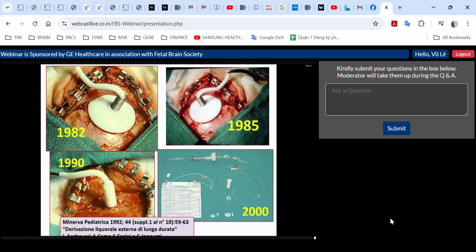For more than 40 years, we have been using a patented device at our institute, created by my first teacher, Dr. Andreussi. To perform the procedure, a ventricular catheter is associated with an MRI-compatible anti-displacement device consisting of a cylinder, a plate and a washer fitting the cylinder.